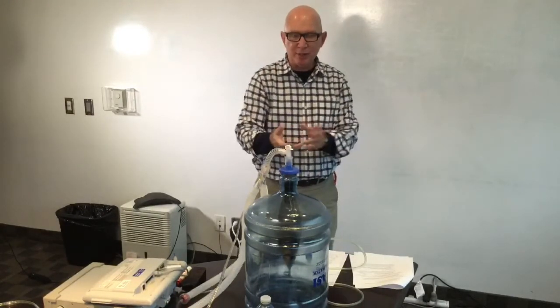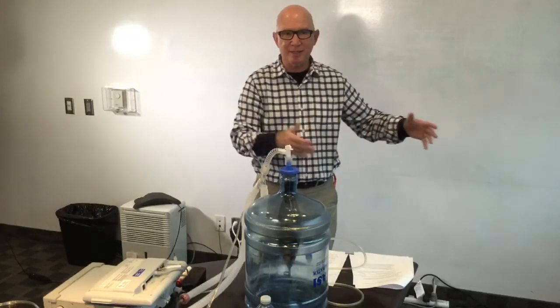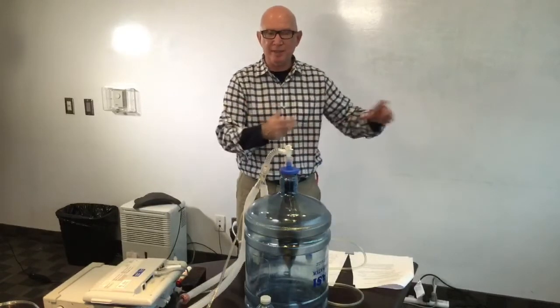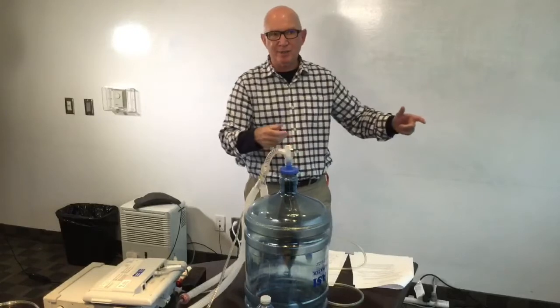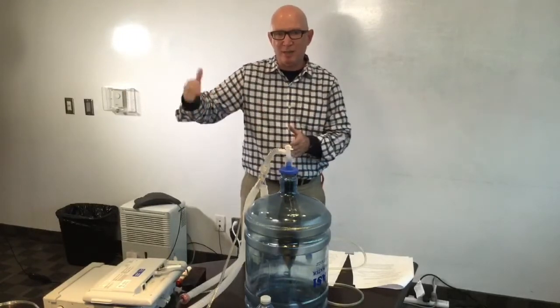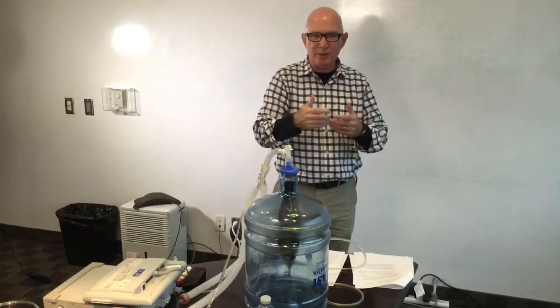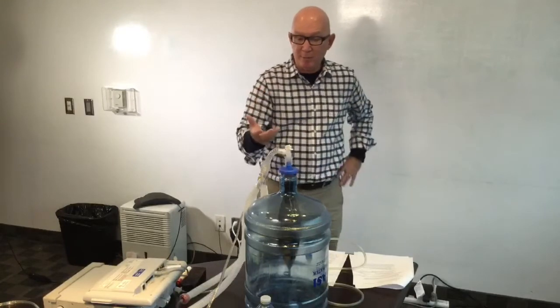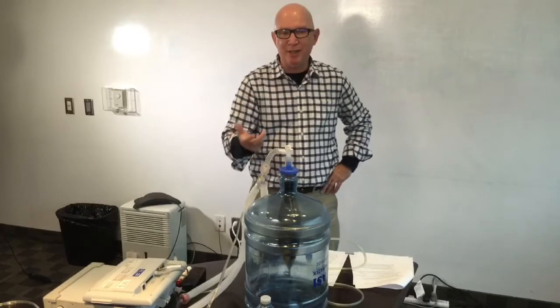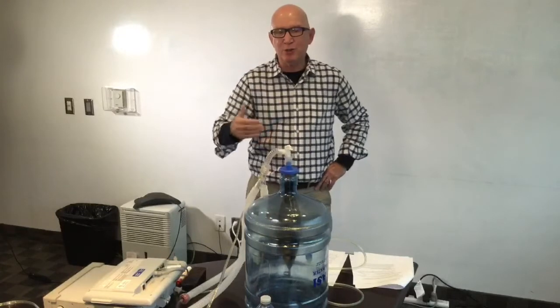But when the literature talks about breath stacking in relation to dyssynchrony with the patient and the ventilator, it's typically talking about 2 breaths that might come in back to back when there is an incomplete exhalation of the previous breath. So it's not like it's a continuous building of functional residual capacity as breaths stack on top of one after the other after the other. It's sometimes just 2 breaths together that are so close together that it stacks the volume up. And we know, because of the ARDS trials, that this is dangerous for the alveoli and the lung, and sets the patient up for that whole cascade of ventilator-induced lung injury.